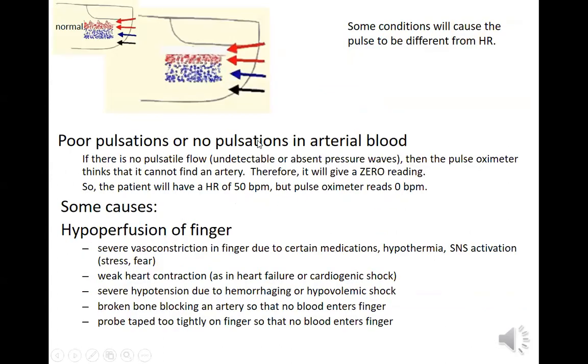So these are the reasons you have low pulse rates or no pulse rates on the pulse oximeter. Now, if you tried the pulse oximeter in here and you didn't get a pulse number, it's okay because something was wrong with that pulse oximeter, or we didn't calibrate it right. But you could see the pulse waves on it. It was pretty good. And you could definitely see the saturation of oxygen, of hemoglobin with oxygen. So these are the causes of less pulse waves.